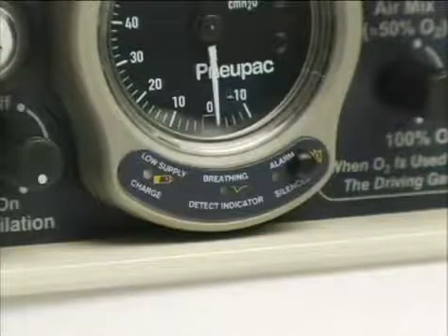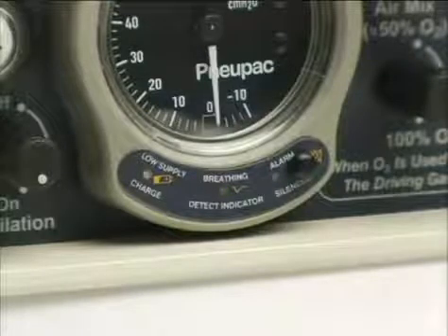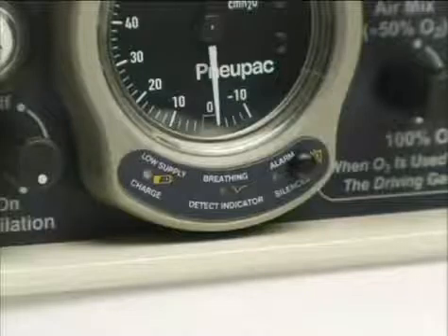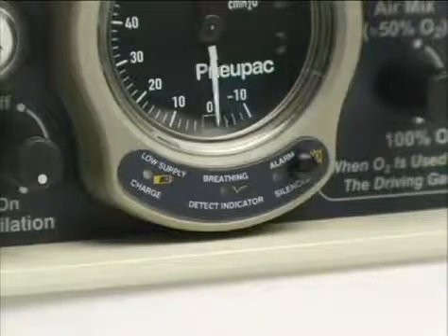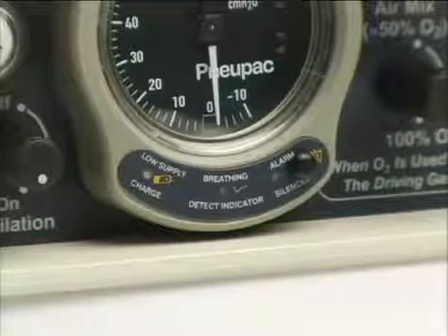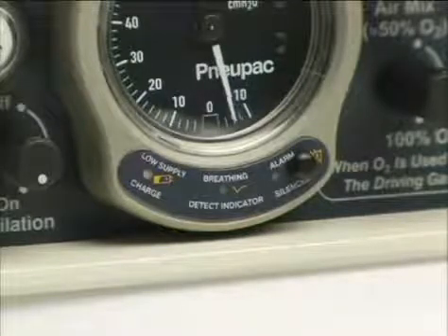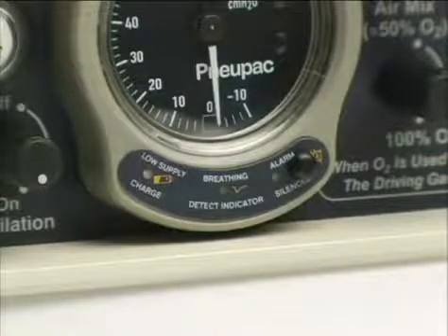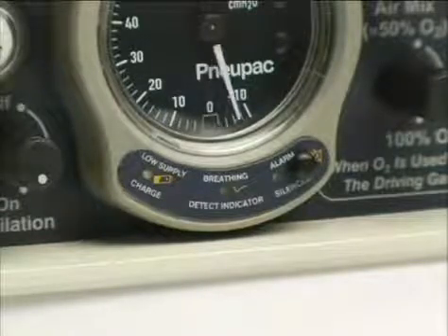This green visual indicator signals detection of a spontaneous breathing effort by the patient. Each time detection occurs, it resets the low inflation pressure or disconnect alarm in the same way a positive pressure resets the alarm during normal ventilation. Resetting ensures that nuisance alarms do not result from the absence of positive ventilation that occurs when the patient is breathing spontaneously.